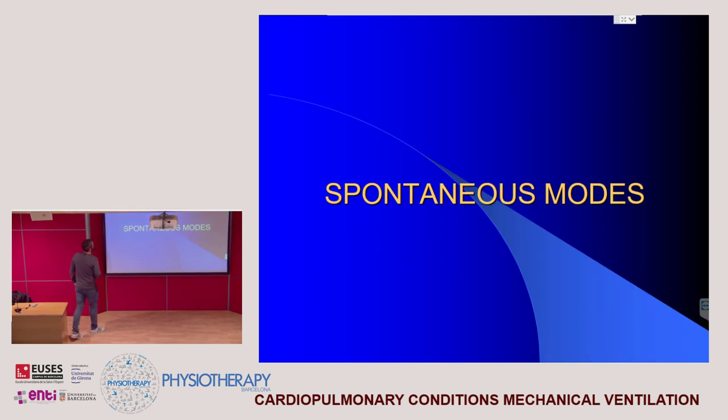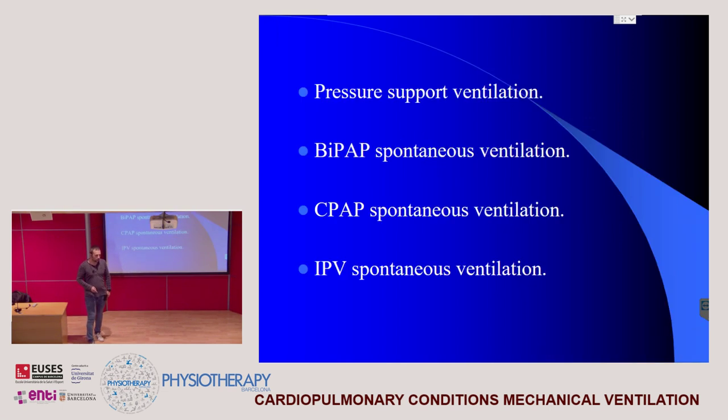And then we have the spontaneous mode. There are different kinds of spontaneous mode, but today we will talk more deeply about two of them, and the other ones we will pass quickly because there is something that we have talked about already.